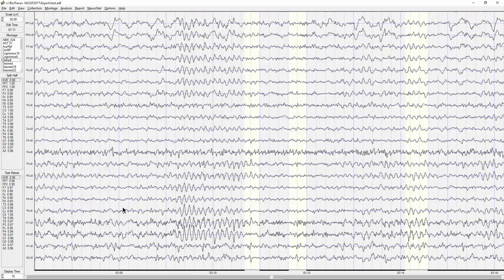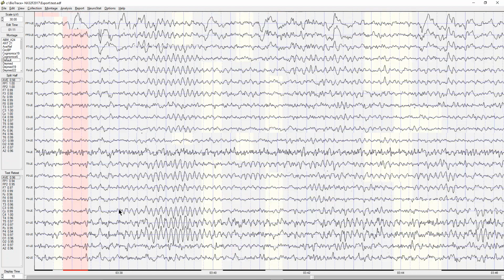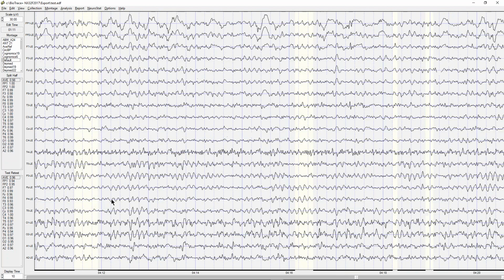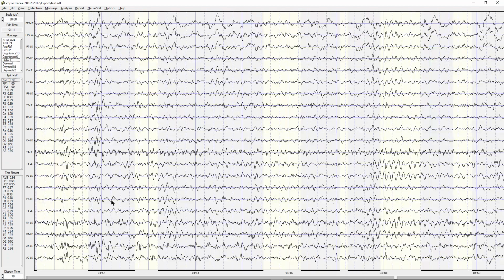I'm curious about who this might be. This is the John sample file that comes from Mind Media. So it's somebody over there in Europe is a bit overactivated.